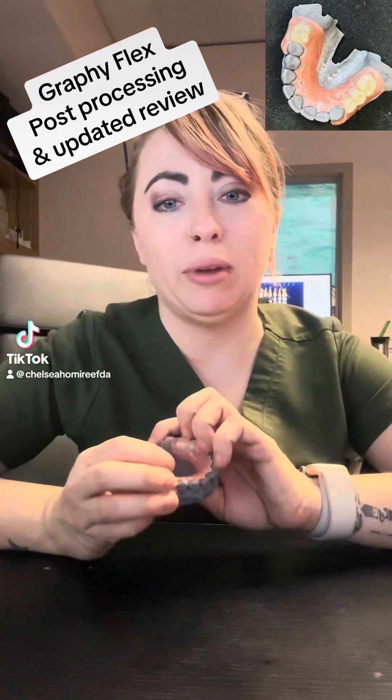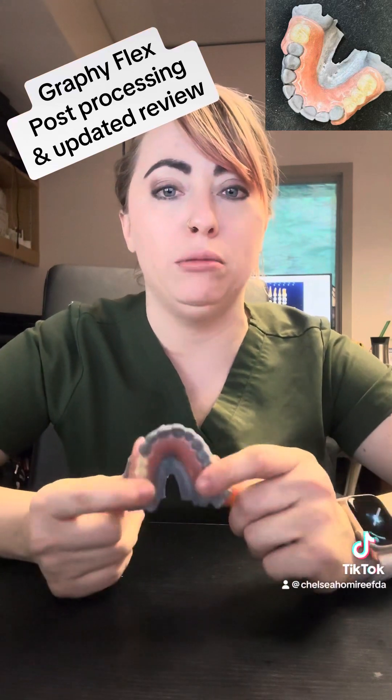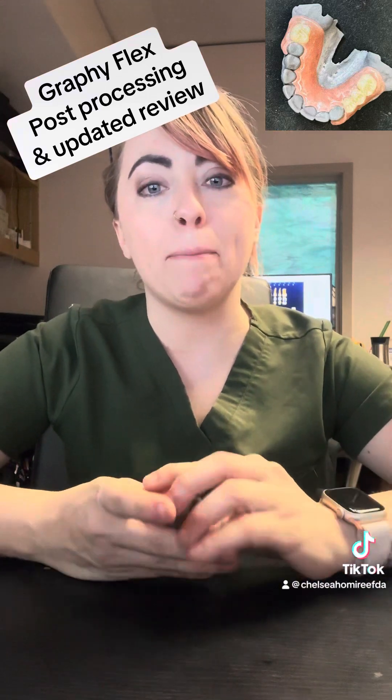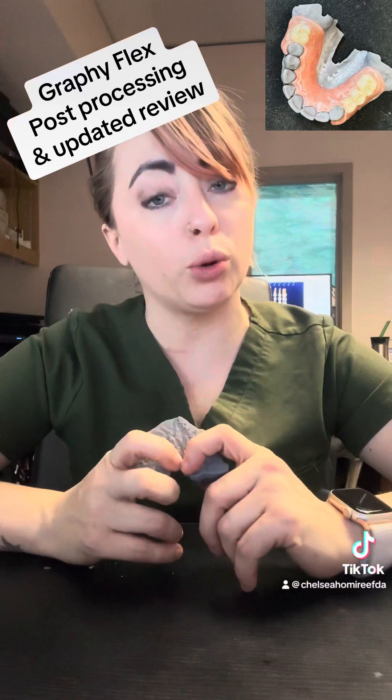I've been getting a lot of questions about how we are doing our post-processing with our slightly flexible Graphy material. It finally just got approved in the US, so we're really excited about that. Post-processing is completely different than what we're used to.